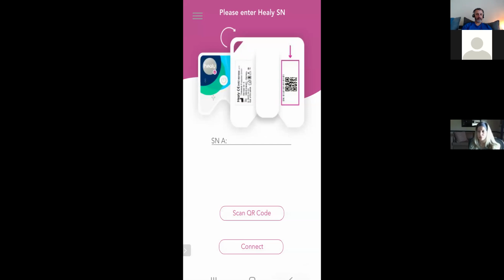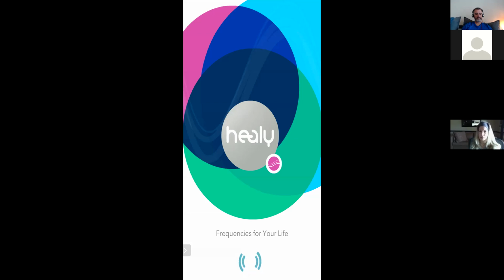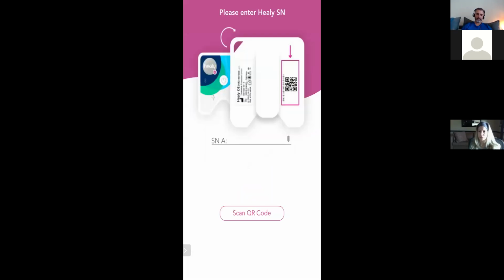I'm going to try it. Well, let's play around with this a bit and see if we can get it to work. I'm going to close the Pink app. Okay, I'm going to open it back up. I see that this one that I've been using isn't on at the moment, so it gives me again the option to scan. So I'm going to go back and try and scan this one here and see if I can get it to work. It is bringing up the serial number correctly, but it will not connect.